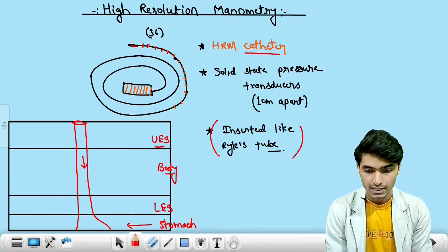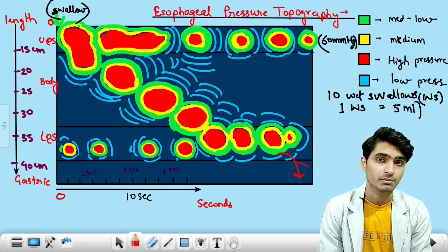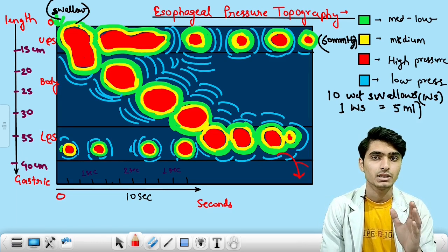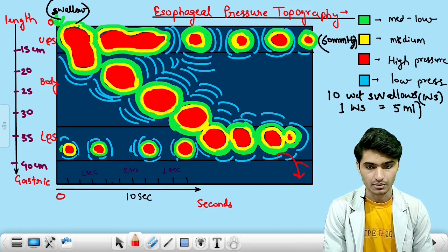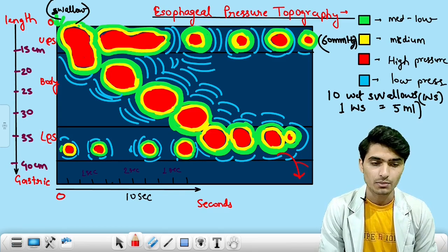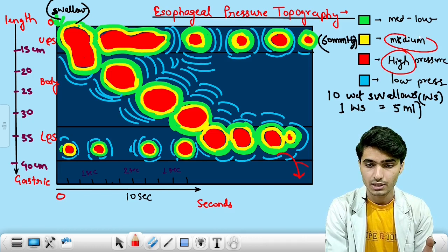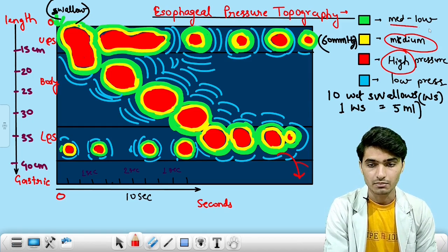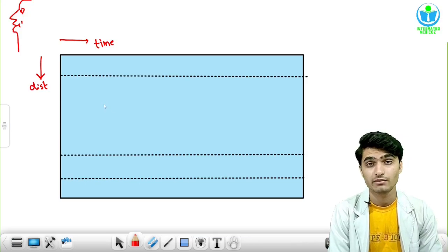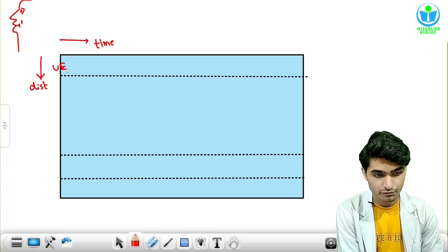Now we will check for the esophageal pressure topography — the graphical presentation of the pressures inside the esophagus measured with the help of the high resolution esophageal manometer. The red colored areas are the areas of high pressure in this topogram. The yellow colored areas are the areas of medium pressure, subsequently the green colored ones are medium to low pressure areas, and the blue to sky blue colored areas are the areas with low pressure. We measure the distance from the upper incisor, and this strip is the upper esophageal sphincter.